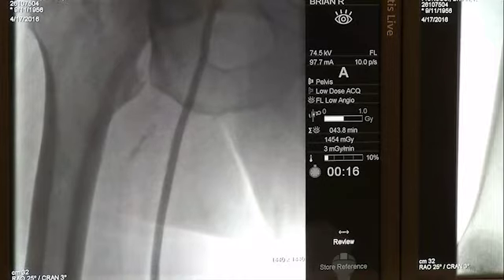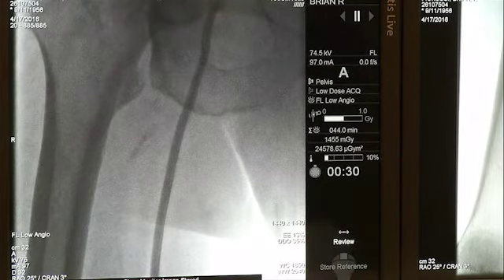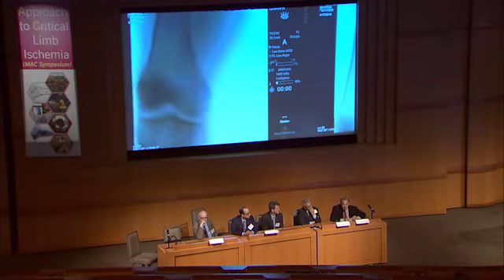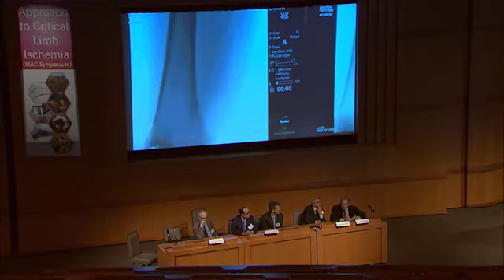Sure. So one of the things he's doing here is it's very important if you consider using Supera. I would say that 9/10 of the battle with Supera is vessel prep. If you don't prep the vessel well, then the stent comes out elongated, you don't have proper architecture, you lose the mechanical advantages that you sought out in the beginning. And so a good prep is everything, in my opinion. Okay. And when I've seen people fail with that device, it's usually because of poor prep. Go down.